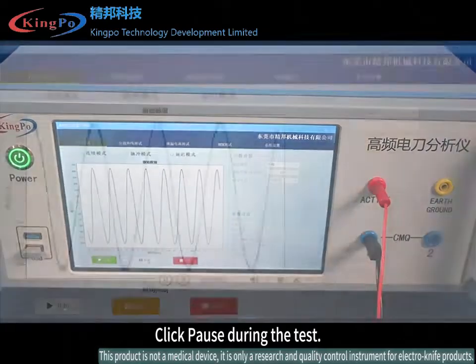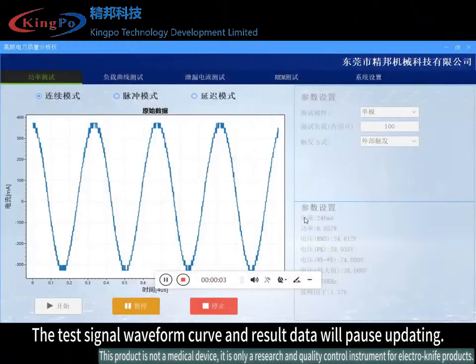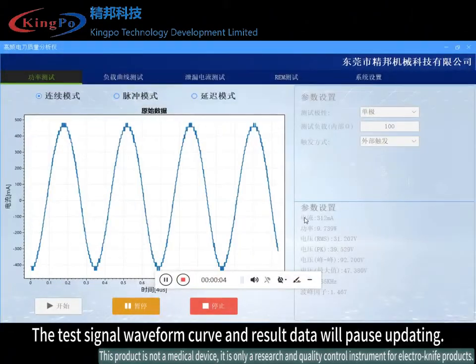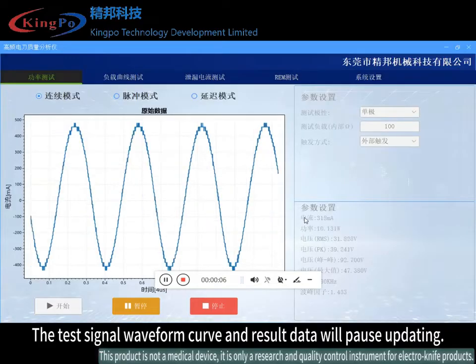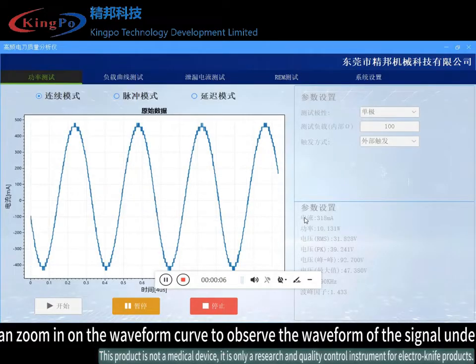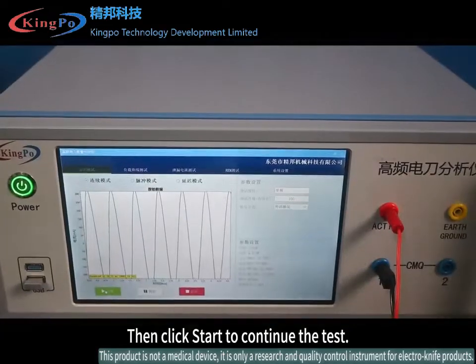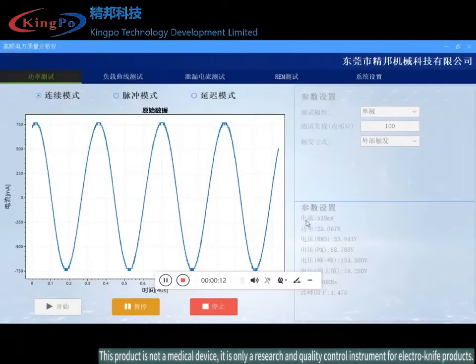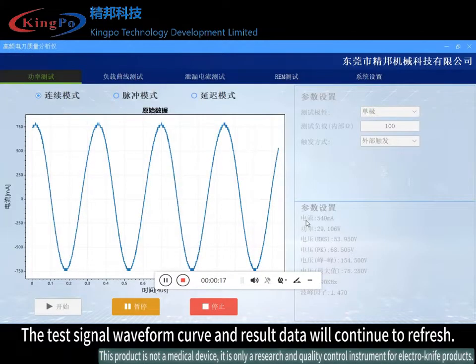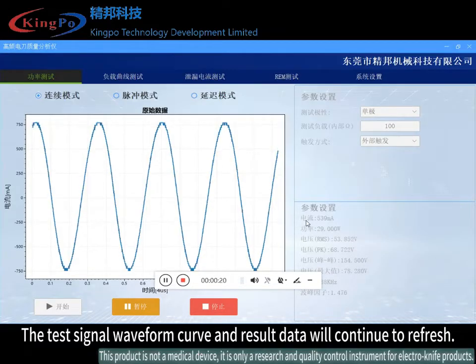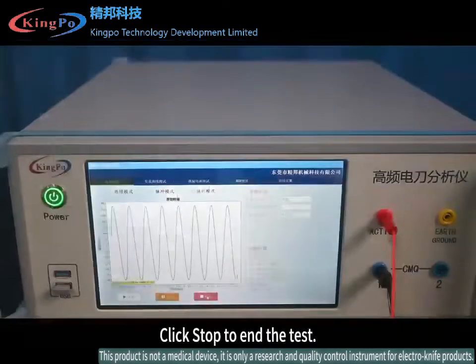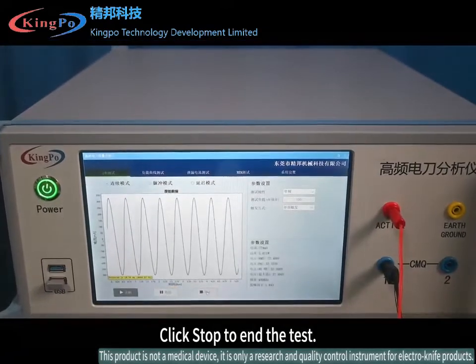Click pause during the test and the test signal waveform curve and result data will pause updating. You can zoom in on the waveform curve to observe the waveform of the signal under test. Then click start to continue the test, and the waveform curve and result data will continue to refresh.